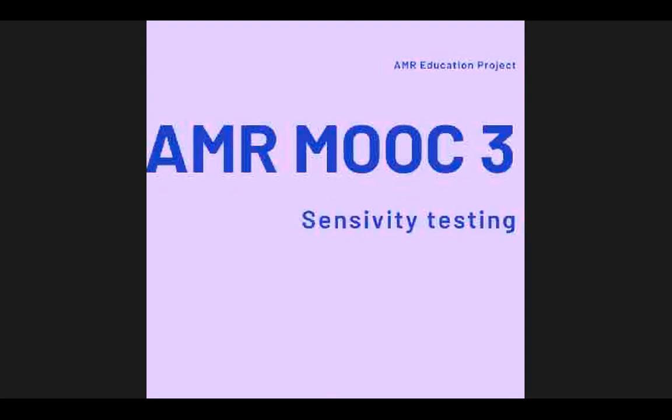Kichana asked about technical area of uncertainty and intermediate. So ATU versus intermediate, if there's any difference. And I think that there is no difference. In the end, these are just terminologies that people have made up to say they're uncertain. It's sort of an intermediate resistance, and I think it depends on the subpopulations. So if there's a colony inside, whether they decide to report that or not depends on the lab. I don't like these.